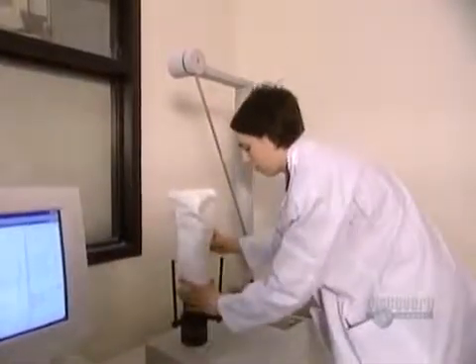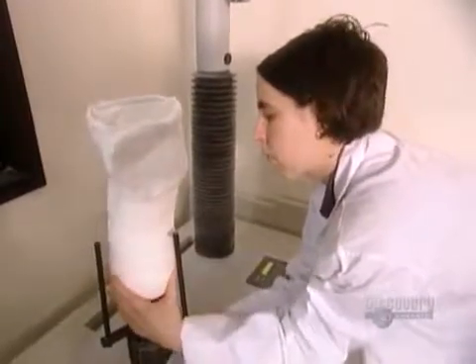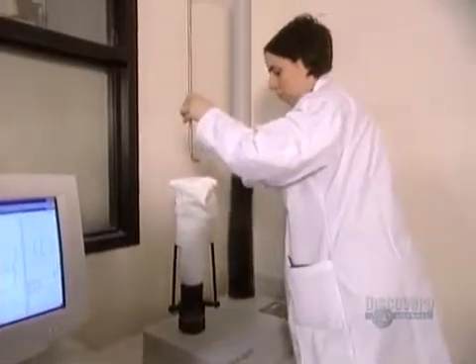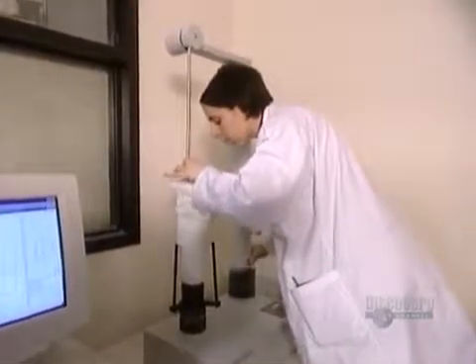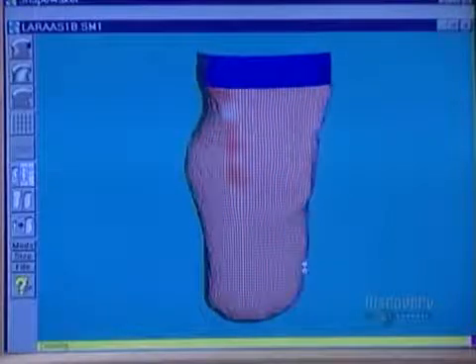Often, they use a different technique to make the positive mold. They build a negative mold first using strips of plasterized cloth, much the same way they make a plaster cast when you break your leg. Then a scanner takes a detailed three-dimensional reading and programs it into a computer.